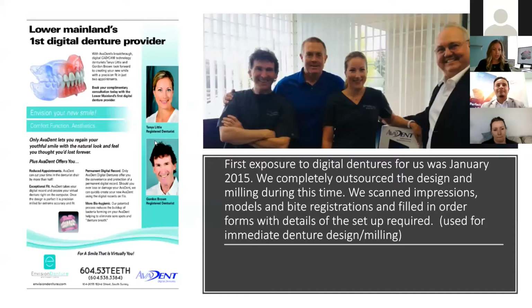So my digital journey started back in 2015. My good friend here, Gordon, we've been working together for 10 years. We were lucky enough to go to Arizona to meet Kent and Gerald here at Avident and spend 3-4 days with them to learn about what were digital dentures. You know, that was 5 years ago. Really, this was wow factor for us.